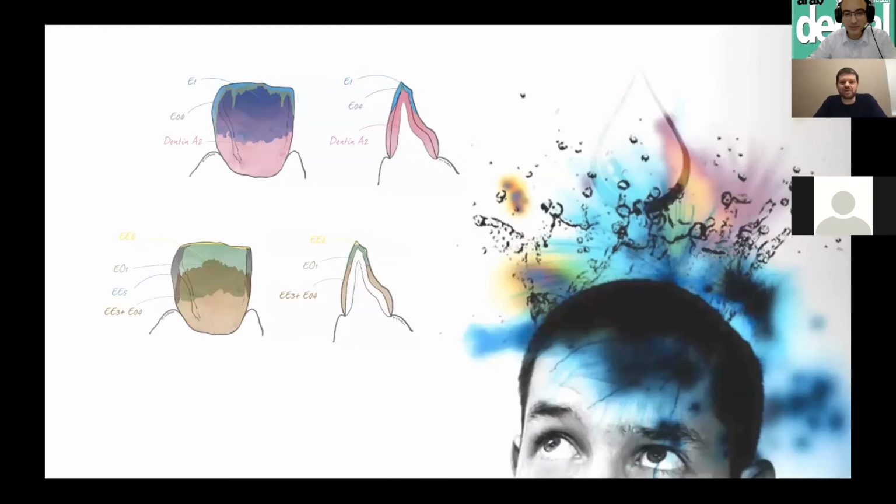At the time of my master classes and lectures, schemes of layering, schemes of stratification, or schemes of applying stains, that's the part that attracts the biggest attention of the audience. But I always say to dental technicians who are visiting my master classes, please, it's not enough only to fix these schemes. Please try to understand their logic. This way, you will be able to become the author of the schemes yourselves.